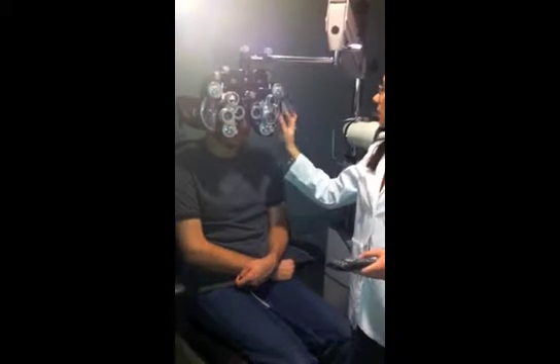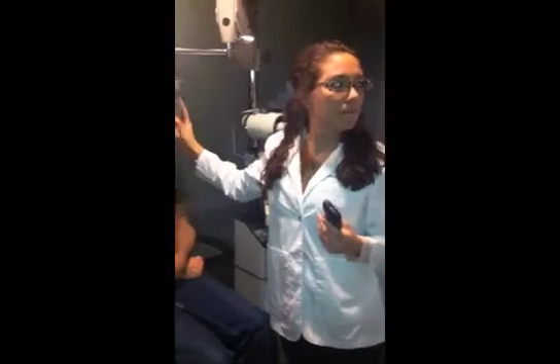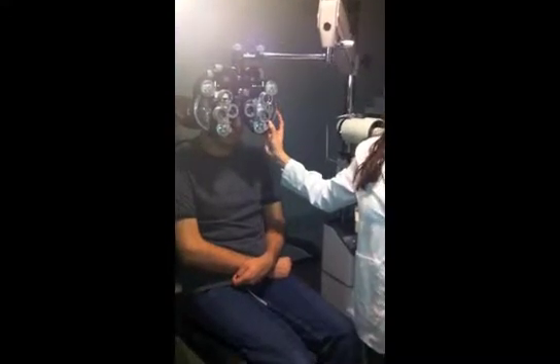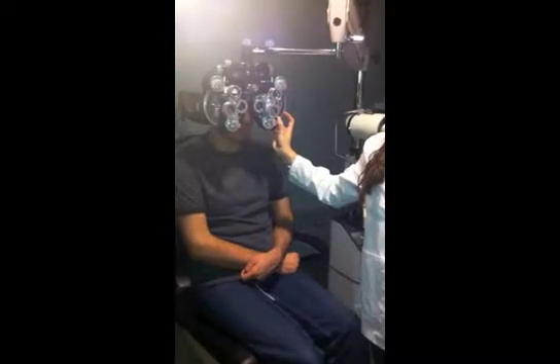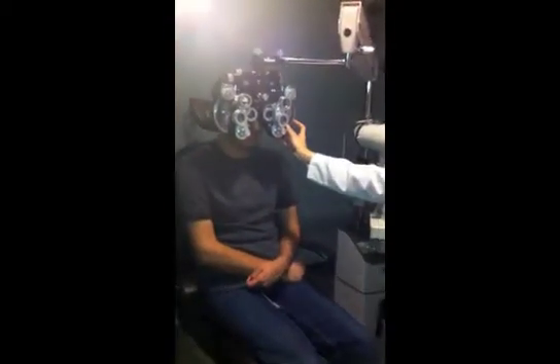I'm going to make things blurry. Can you see it now? No. Let me know when you first see one letter in that line. Anything yet? K on the end. Is this clear for you? Yeah. Read it for me: O, F, R, K, R, T, F. And this line, give it a shot for me. A, S, F.